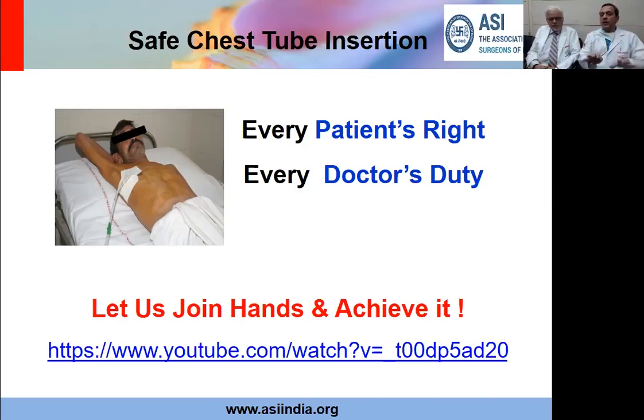And the voice getting affected is the last thing. So the first thing is to check the position of the chest tube. The commonest cause is a hole lying in the subcutaneous tissue. So please look at the chest x-ray carefully and see whether the hole is lying in the subcutaneous. If so, that hole needs to be inside.